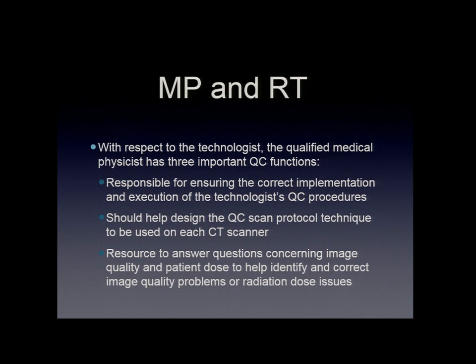So just because the protocol looks the same, that doesn't mean that you're going to get images that are going to be the same. So as the medical physicist, we need to work with the CT to establish the protocol that would be acceptable for the QC program. And then, of course, we're a resource that if there are any problems, if QC does go out, they can call us and let us know, and we can give them guidance on what they need to do.